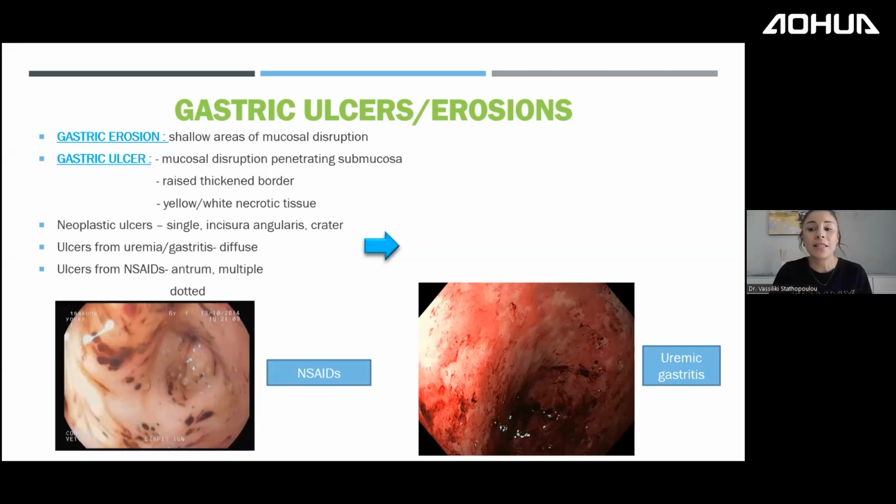And having said that, a good biopsy will give you the results, because you might have a very nasty adenocarcinoma, for example, or an adenocarcinoma in the very early stages, and your biopsies could be from the necrotic center, for example. So there you will only see necrotic tissue and not neoplastic tissue. So you will have a false diagnosis.